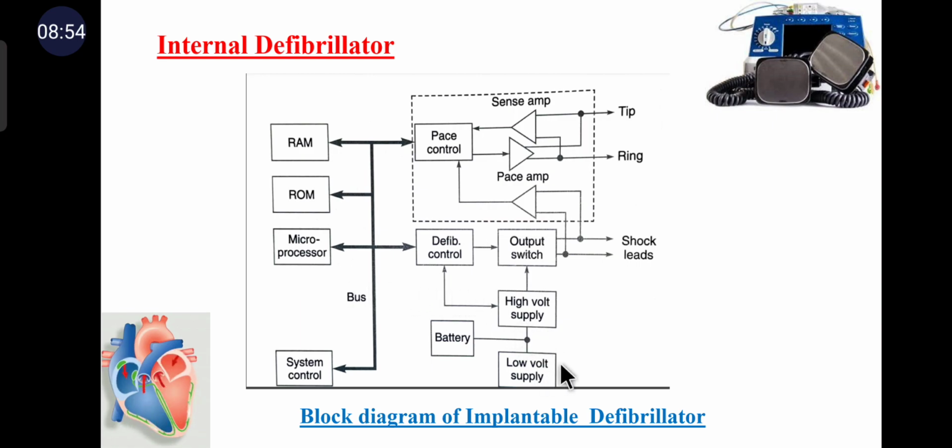The power supply to the circuit usually comes from lithium silver vanadium oxide batteries. Digital circuits operate from 3 volts, whereas analog circuits typically require a precision nanoamp current source as input. And the high power circuit converts the 3 to 6 volt battery voltage to the 750 volts necessary for the defibrillation pulse, stores the energy in the high voltage capacitors for timed delivery, and finally switches the high voltage to cardiac tissue, or discharges the high voltage internally if the cardiac arrhythmia self terminates.